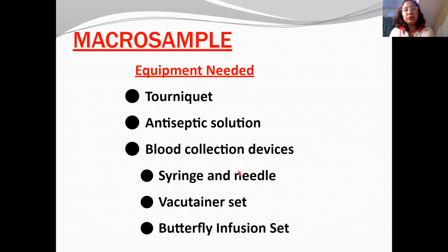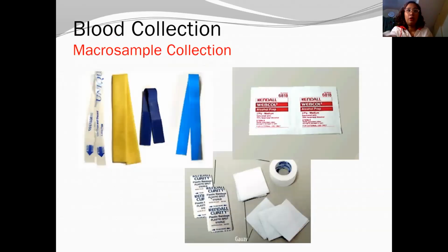So, you have to assess, you have to get good quality needles or vacutainers. Yan. Sa amin na, Terumo. Yan, maganda. Pag Terumo, other brands parang hindi okay. Tapos may mga vacutainer tube pa dati, guys, na parang mababa yung pressure nila. So, ibig sabihin, hindi quality yung binibenta nilang vacutainer. So, you have to find a good supplier as well. Yan, linisin nyo yung tourniquet nyo.